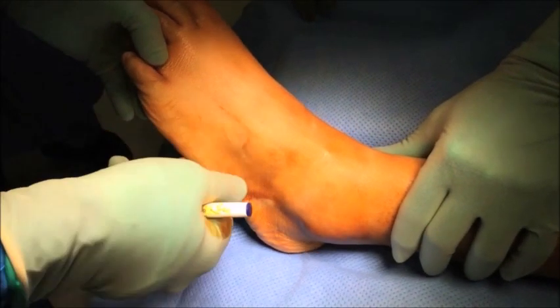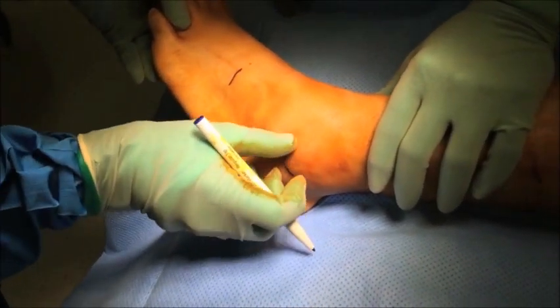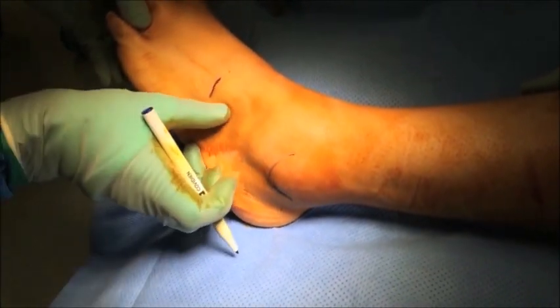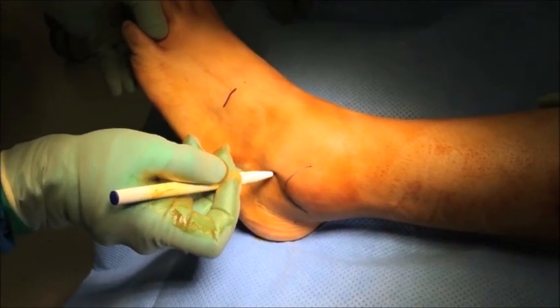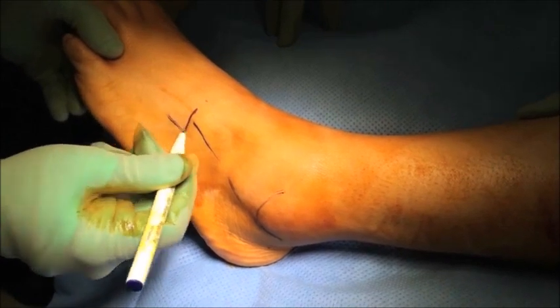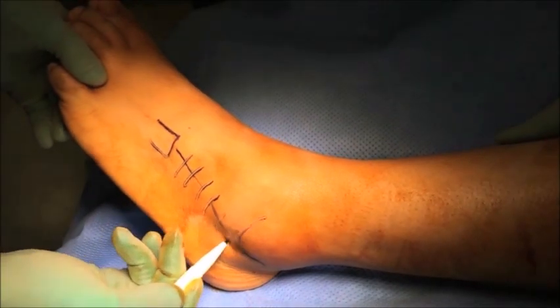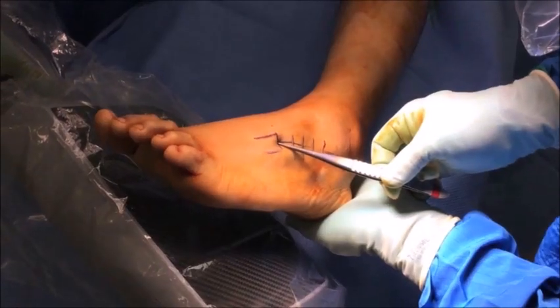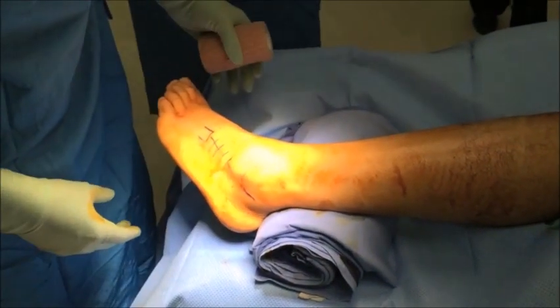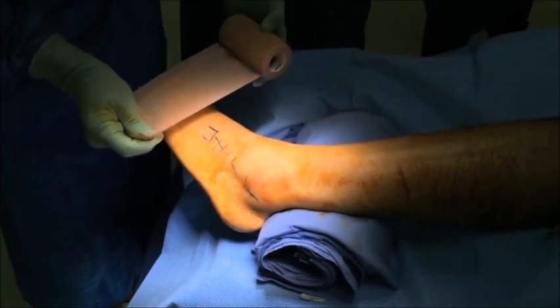The patient is positioned supine on the operating table with a bump under the ipsilateral hip so as to internally rotate the leg. This allows good visualization of the lateral aspect of the foot. Next, the incision is marked on the foot by identifying the appropriate anatomy. The incision runs from the tip of the lateral malleolus to the base of the fourth metatarsal. Make sure the foot is at the edge of the table as this will assist when inserting the hardware and help with better visualization of the surgical field.